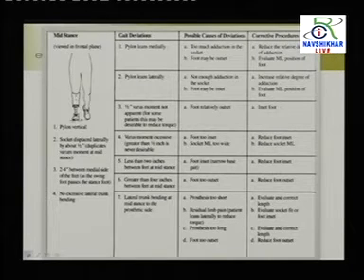Then we have the pylon, which ideally should be vertical. It is not vertical. It is either medially shifted or laterally shifted. By changing the alignment, because he has his own knee, he has the knee power. So the deviations in below-knee are very few. In this case, the knee joint is natural, so for most of the gait cycle, the control on the prosthesis is maximum because he has a complete thigh section and the natural knee joint.